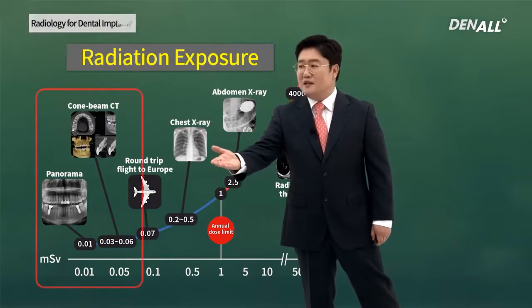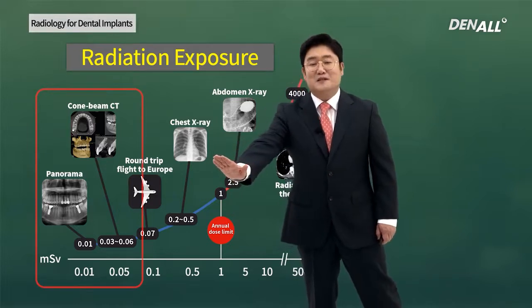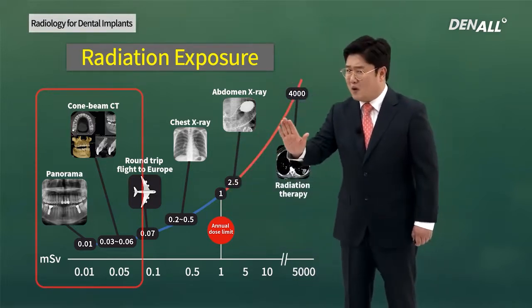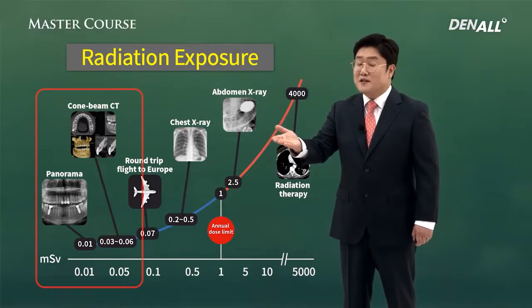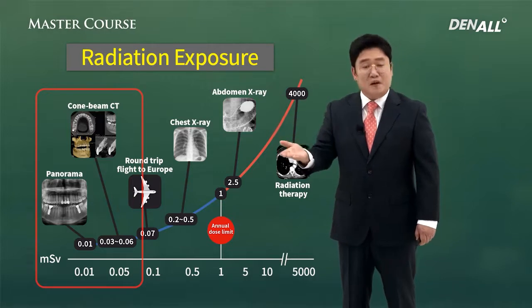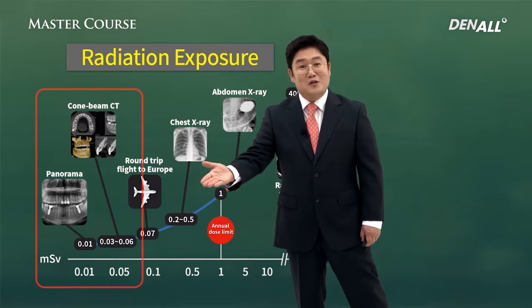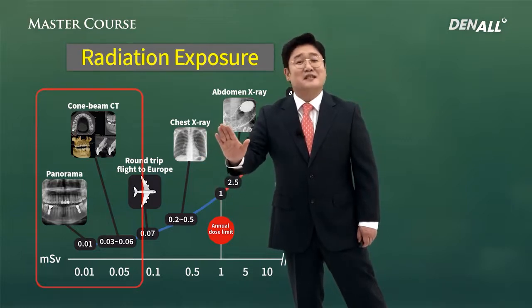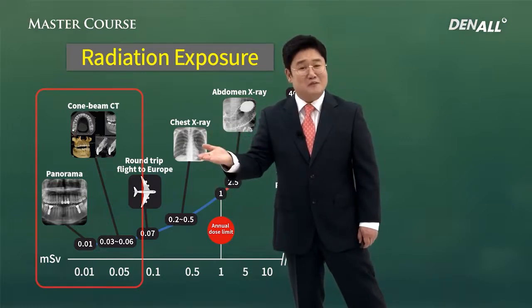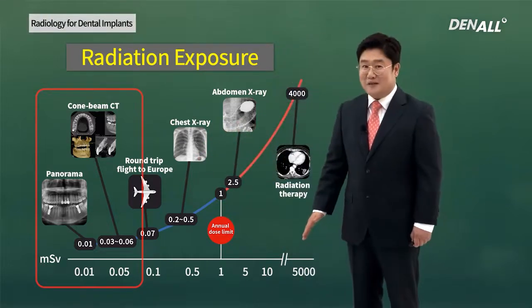Panorama, CT has very low level of exposure. Standard periapical would be much lower than this, so it doesn't appear even on this diagram. When you explain this to your patients, maybe you can say this: round trip flight to Europe has more radiation exposure than dental X-rays. That means dental X-rays are very safe procedures.